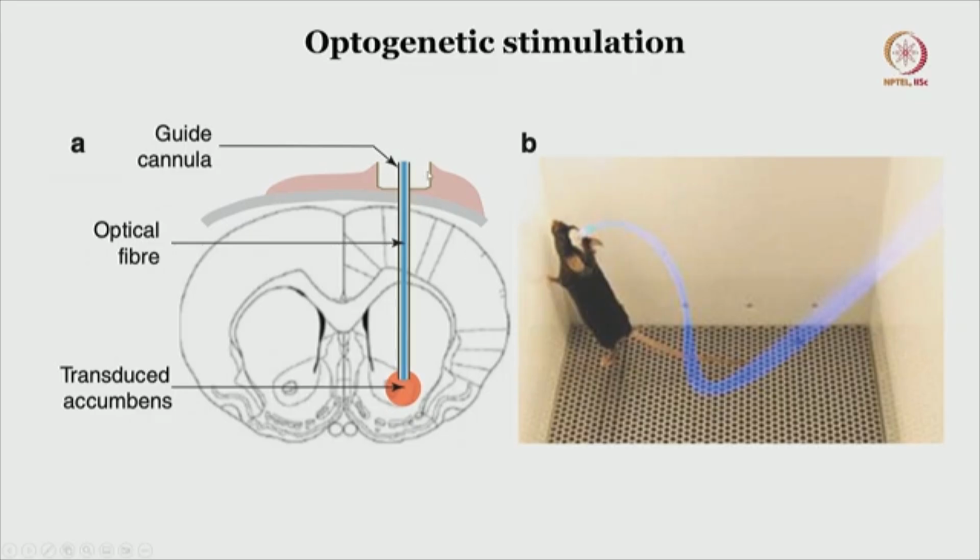So this is the cranial window that we have performed, and if you all recollect, a cranial window is performed and there is a PDMS sheet you can have, or you can have an artificial CSF, or you can have a permanent cranial frame which will hold the guide cannula, or for that matter you can fix it permanently using dental cement and leave the cannula in situ, which can be closed or open as and when you want to do the experiment using the optic fiber cable, which will pass through the cannula and stimulate that particular target, alright.